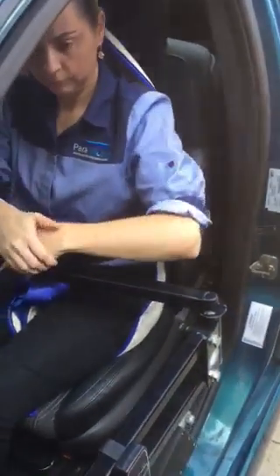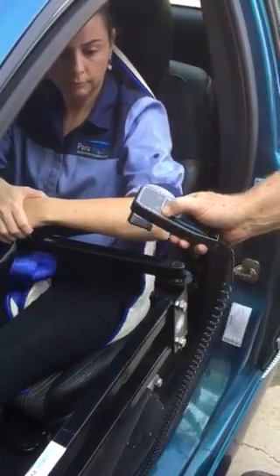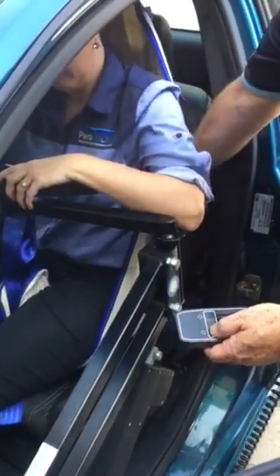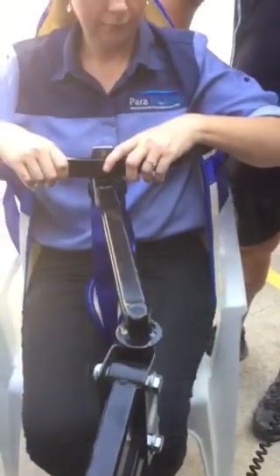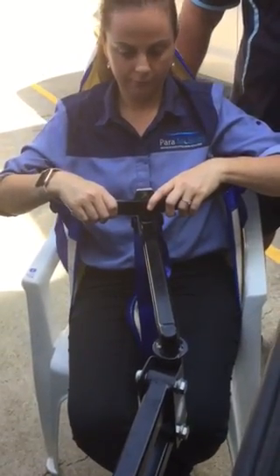You'll note that we haven't moved the sling during the car travel. At this point I'm able to simply lift Tanya up again. Again, we'll have the chest bar roughly in line with Tanya's chest. Once Tanya is starting to come off the seat, we can then bring around, pull back out, locate the wheelchair, and then lower Tanya back into the seat.